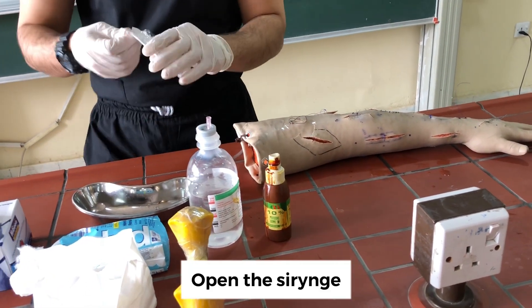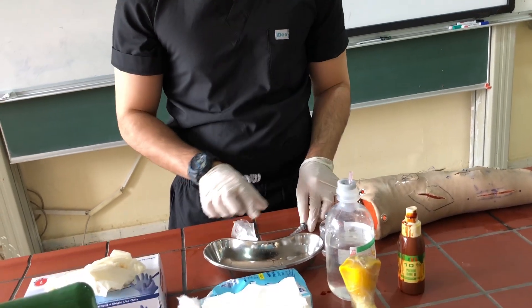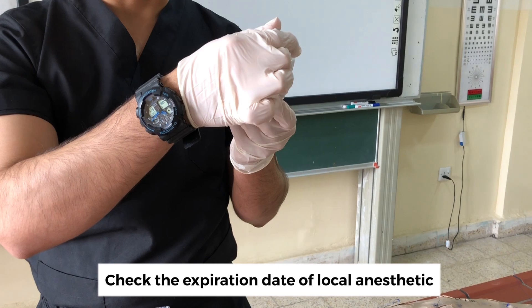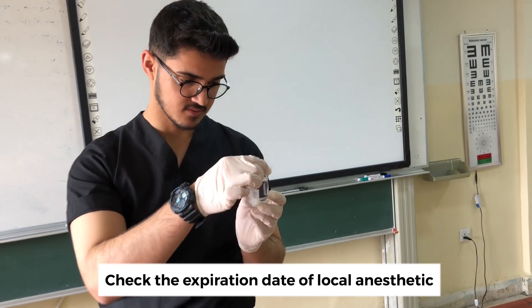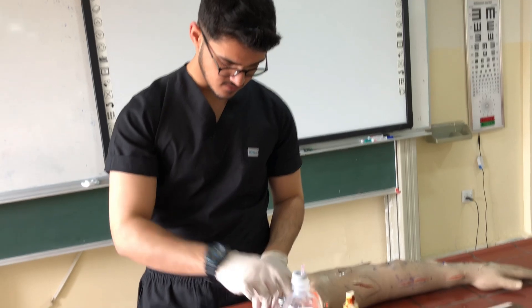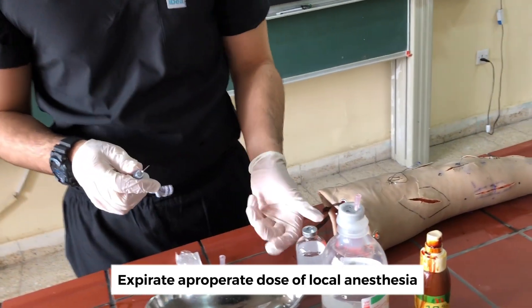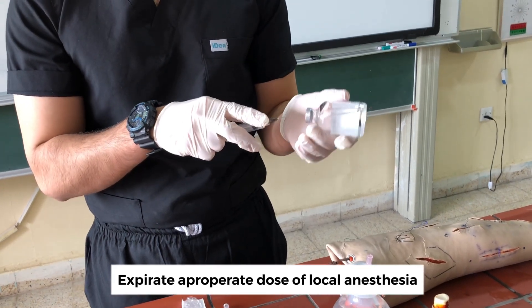Then we bring our syringe, check the expiration date of the local anesthetic, and aspirate the appropriate dose for our procedure.